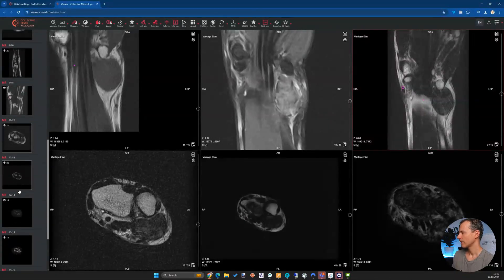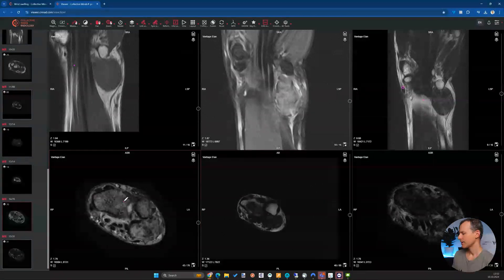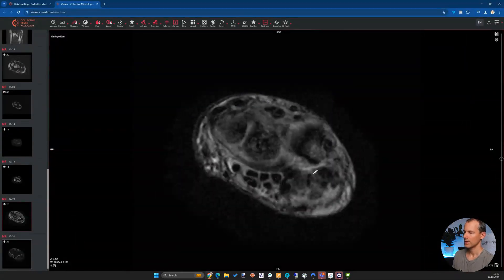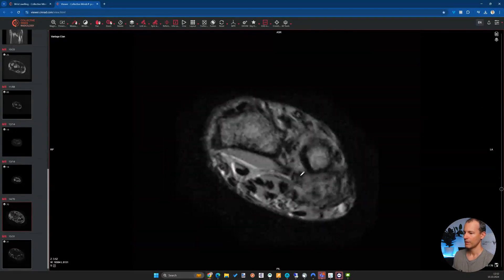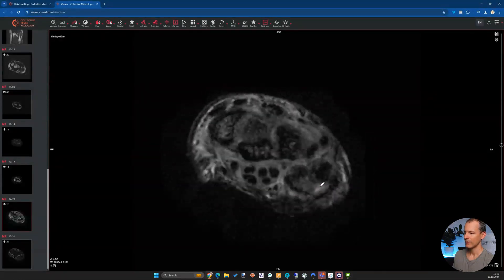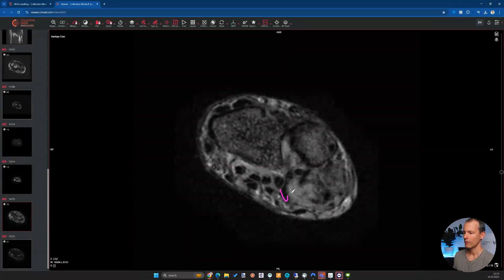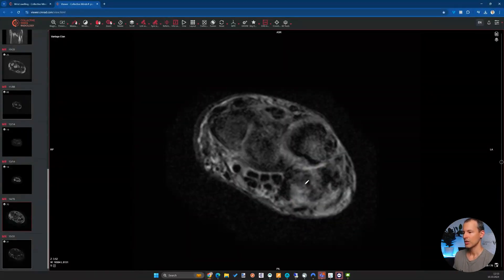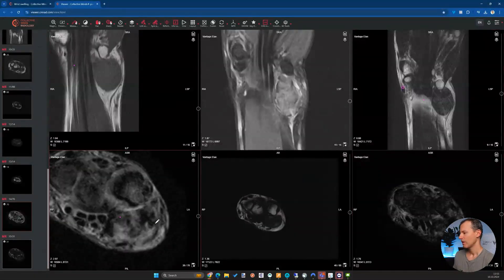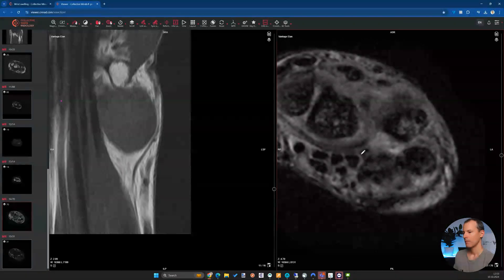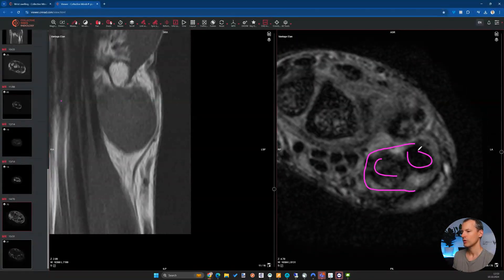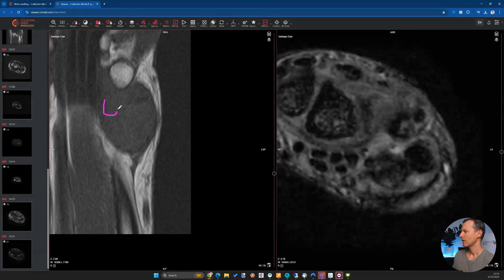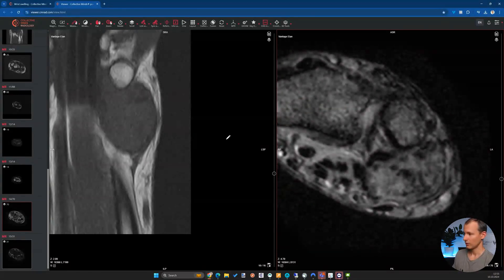Another useful sequence they performed is this gradient echo series. The mass shows quite substantial spotty susceptibility artifacts — predominantly at the periphery but also elsewhere — which means we have hemosiderin or similar material creating these blooming artifacts. It could also be calcifications, but we don't see the same degree of low signal on T1, so these are not calcifications. If it were calcifications, we would also expect to see them as low signal on T1 and on radiograph.